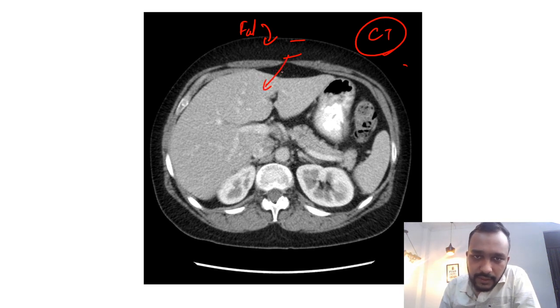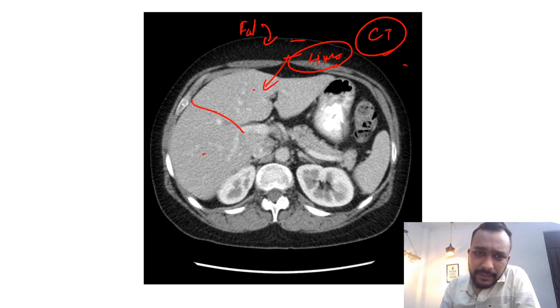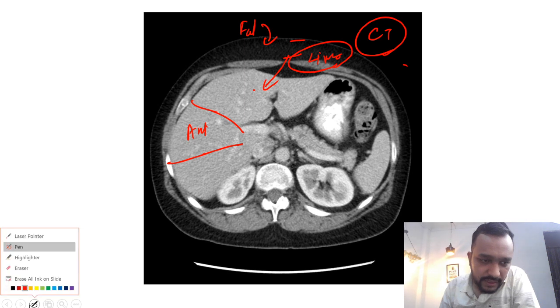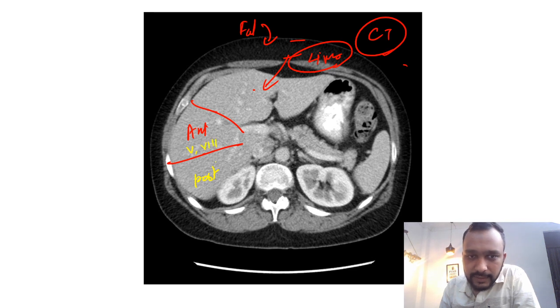This is your liver. The liver is divided into two lobes — right and left lobe — by the middle hepatic vein. In the right lobe you have anterior segments and posterior segments. Anteriorly you have segment 5 and segment 8, and posteriorly you have segment 6 and segment 7.